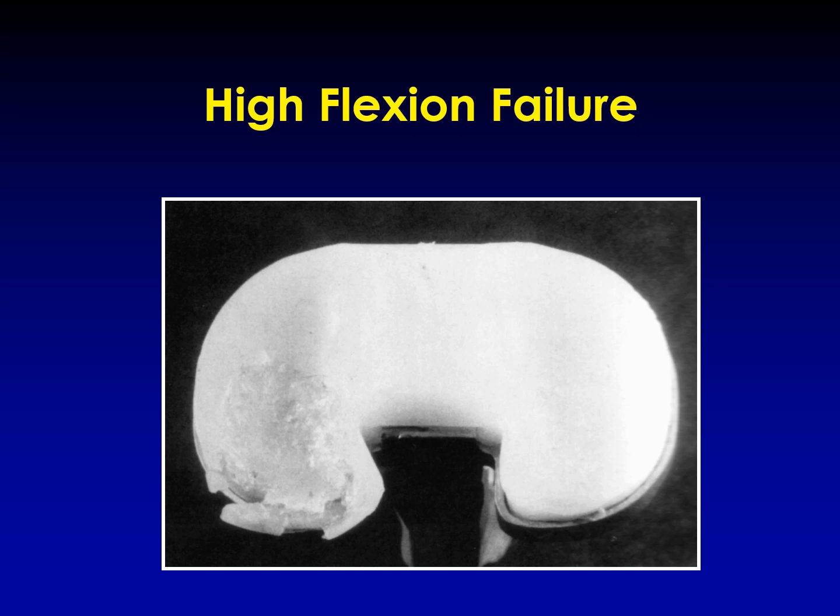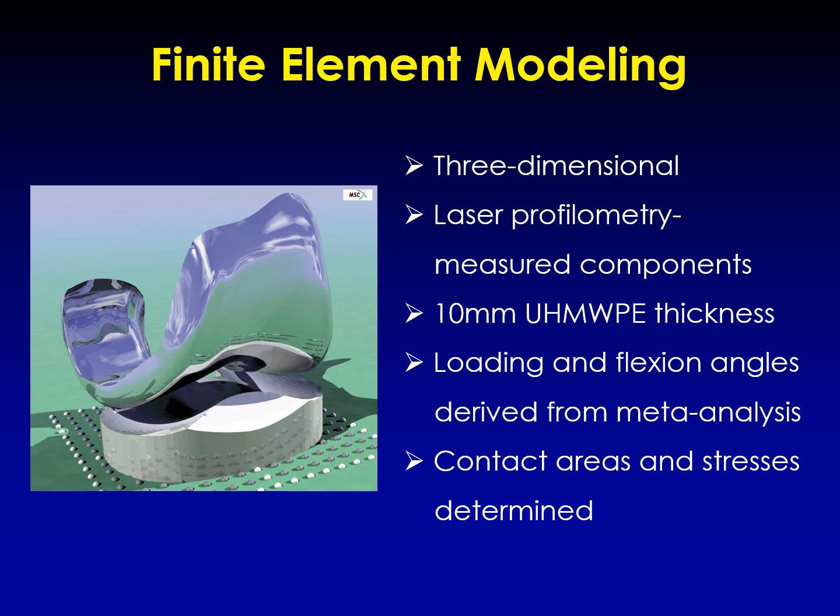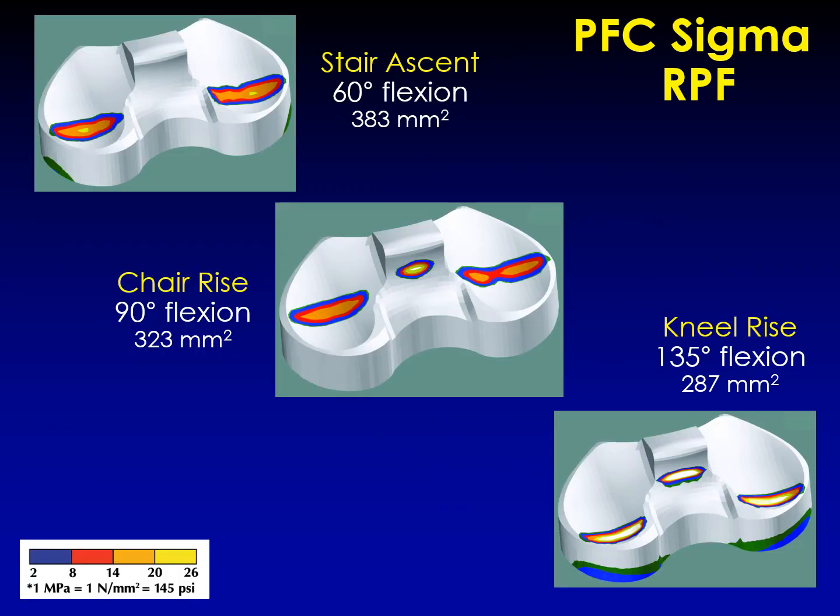Knee plateau damage is noted in the posterior medial quadrant of this right knee through surface abrasion, cracking, and subsurface delamination. To determine surface and subsurface stresses, finite element models are created by measuring the articular surface of implantable quality parts using laser profilometry. Contact areas and stresses on and within the polymer inserts are calculated and photorealistically imaged. Under a standardized body weight, images for the PFC Sigma rotating platform are displayed and provide an indication of areas where damage caused by contact with the femoral component can occur.